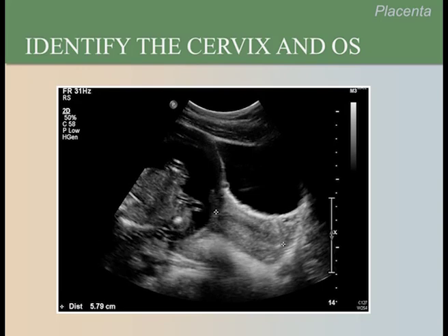The first step is to identify the cervix and internal os. Please pause the video and ask for 1 or 2 volunteers to point out the fetus, cervix, internal os, and bladder.